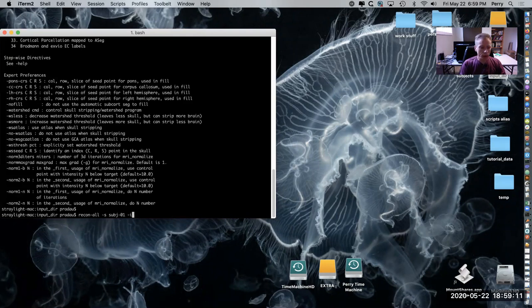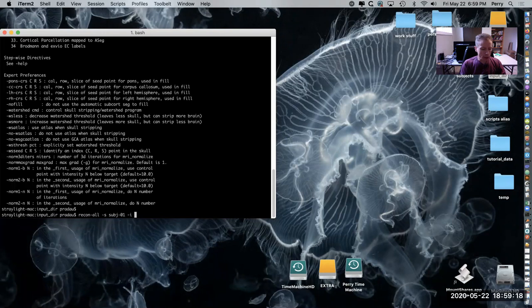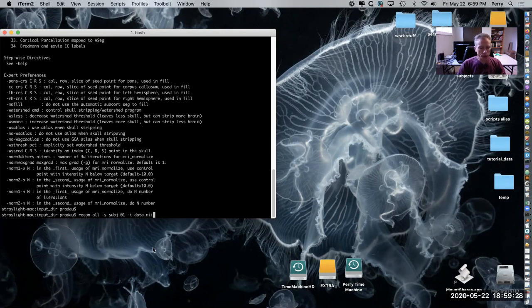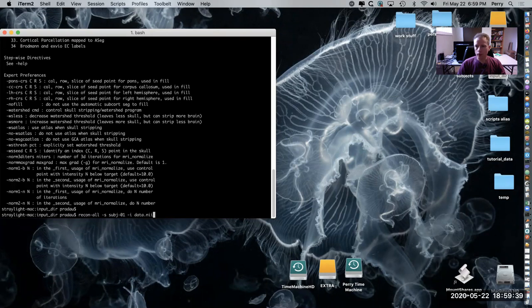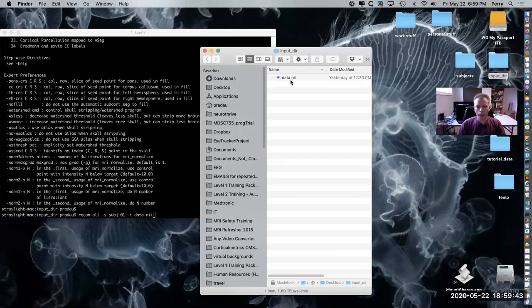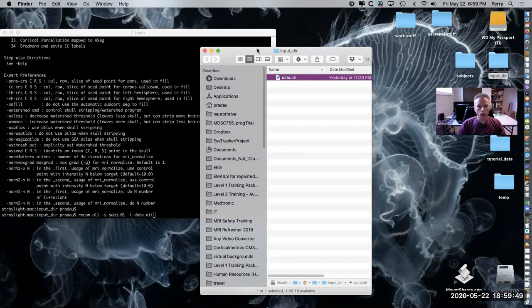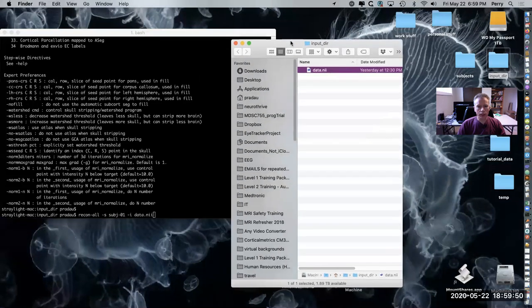Then we want to indicate the input file. Of course you could have multiple files in this directory and you may want to pull it from a different location with the full path name, but we have it in this directory so I can just indicate it this way. Notice you can use a nifty file, not a DICOM, or you could also use a zipped nifty. If it was gzipped for example it could also work - you don't necessarily have to convert it because it will do it for you.